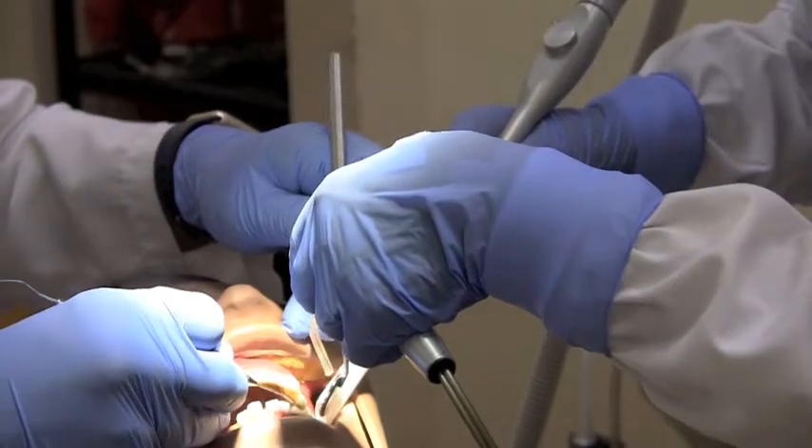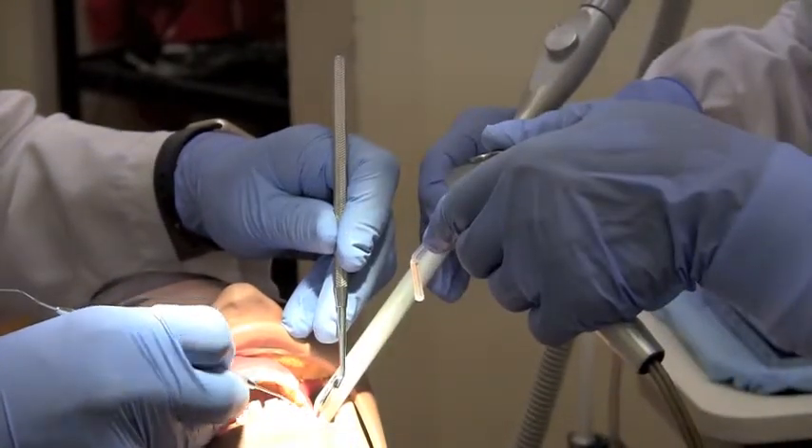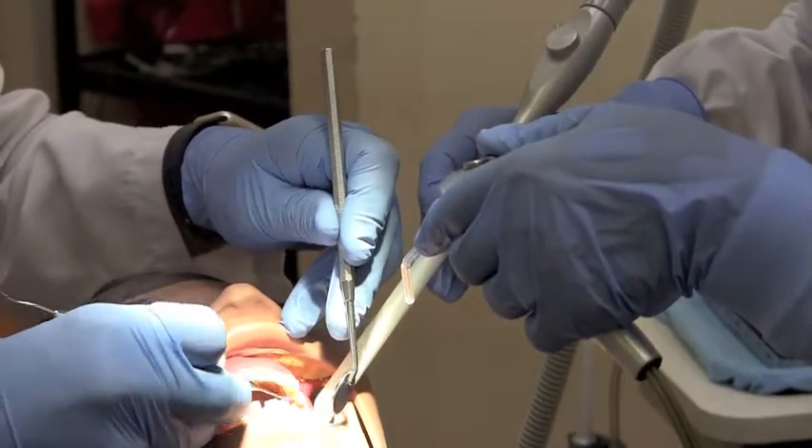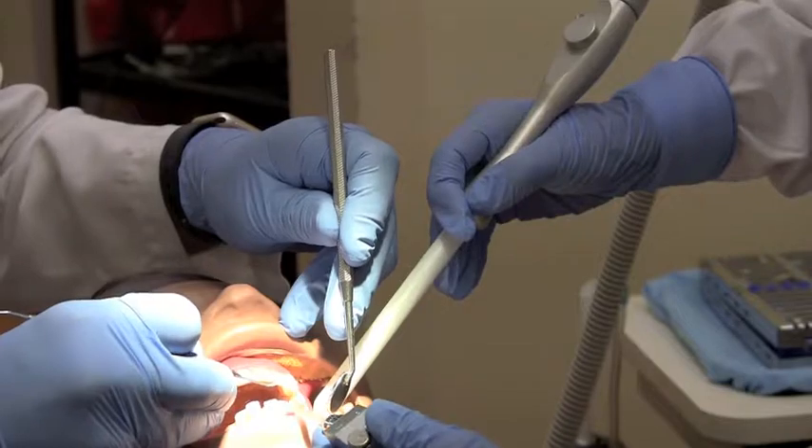The suction tip can be used to retract soft tissue. Ensure it is in position behind the operator's mirror. The air water syringe should be close at hand to dry the mirror or wash the operating field when needed.